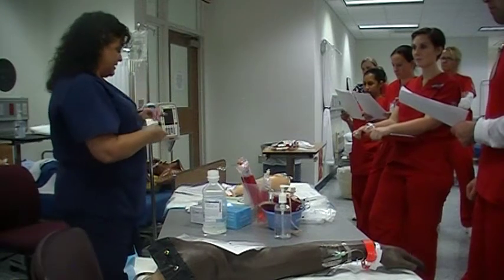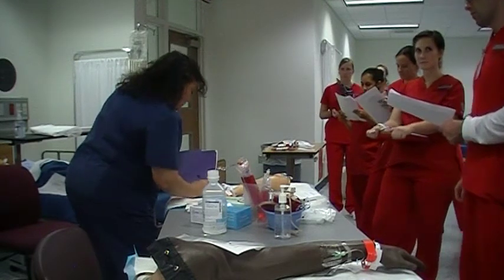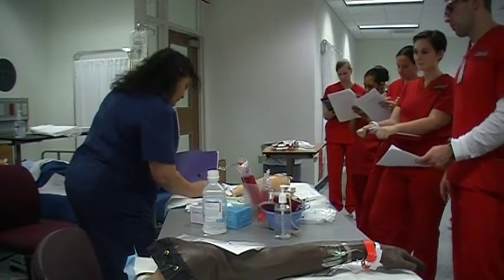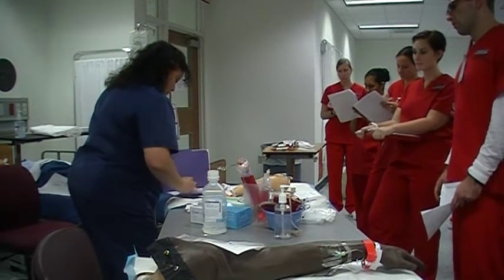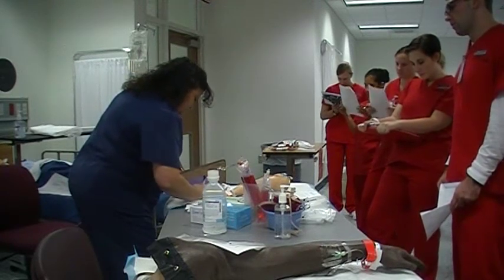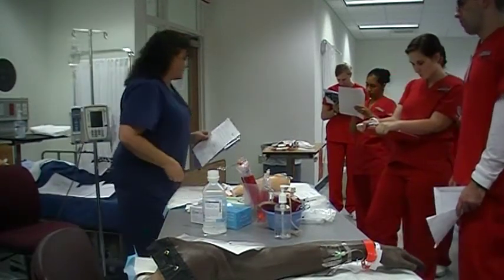So you just have this, and you do want to know your patient's blood type. Why? To get the right type of blood. Right. So we're going to write down that. You also want to know their H and H, so you can see why they're getting blood. And this person, Mr. Davis, is 8.2 and 25.1. His blood type is A negative. Okay. All right. So I'm going to go to the blood bank and pick up his blood.